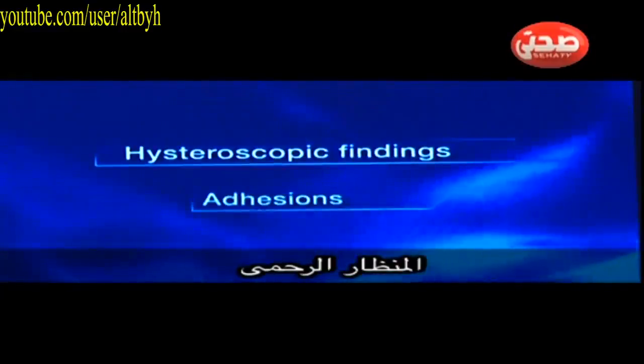Adhesions is also another important finding of hysteroscopy, especially for ladies with a history of hypomenorrhea or thin endometrium on ultrasound scan, and also history of previous DC.